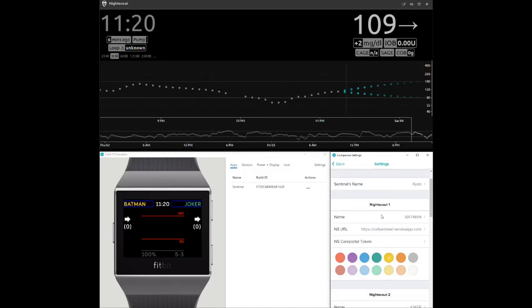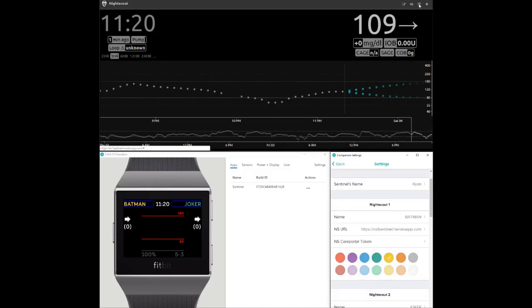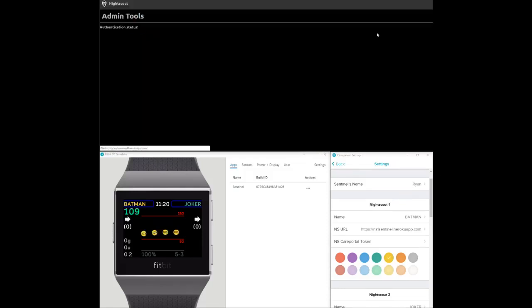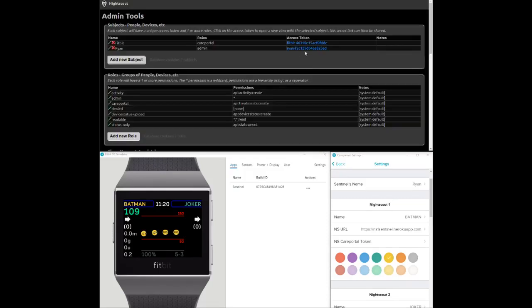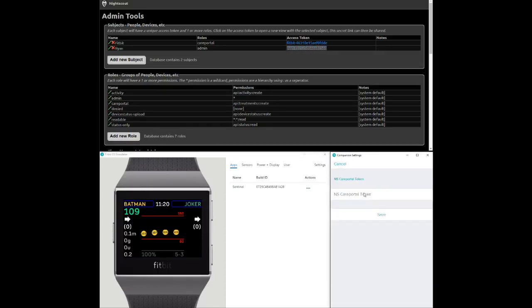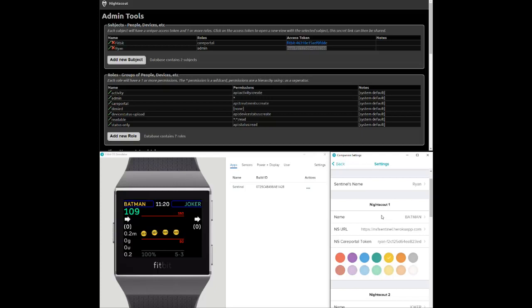To use the integrated care portal functionality, go to your NightScout website, select Admin Tools, and select Add New Subject using your first name in the role Admin. Copy and paste the generated access token into the Sentinel settings field labeled NS Care Portal Token.